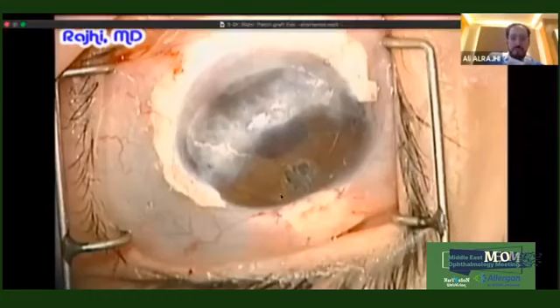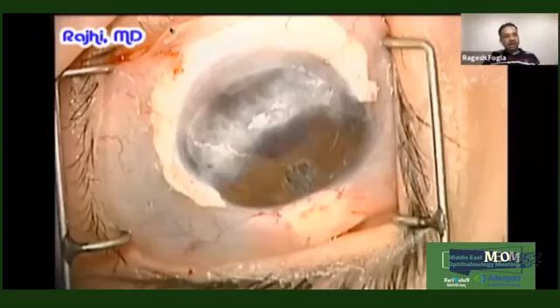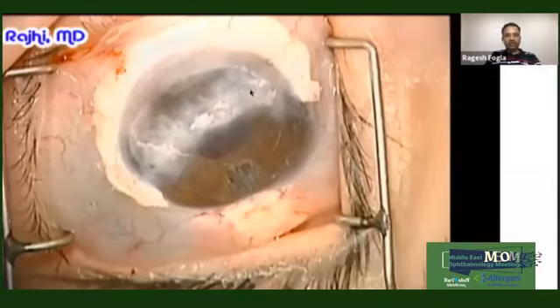I have had some of these cases with Ehlers-Danlos with thin cornea and thin sclera. So what we have done is what is called epikeratoplasty. So in these kind of cases, to reinforce the cornea, you can do a 360-degree conjunctival peritomy. And when you're doing the peritomy, you try to harvest the limbal palisades within the peritomy so that you don't lose out on the limbal stem cell.